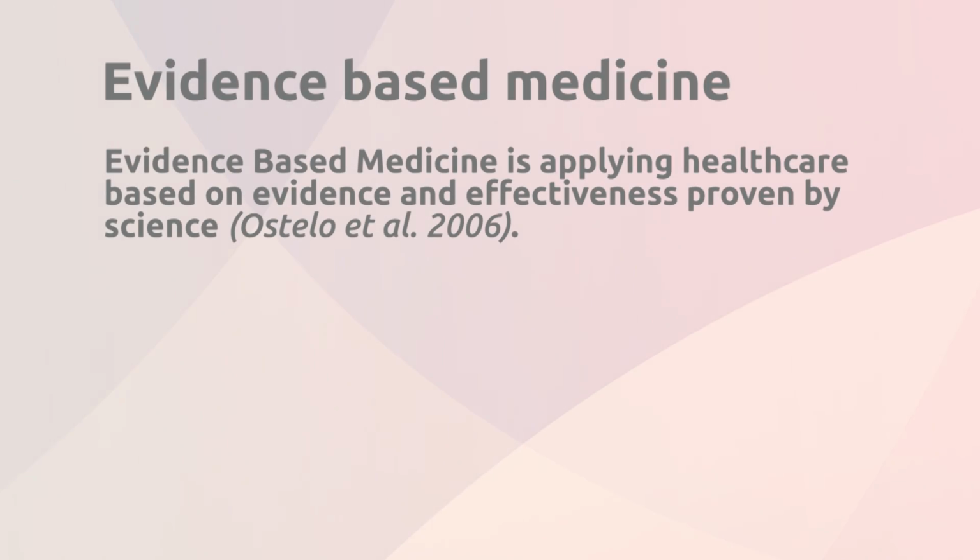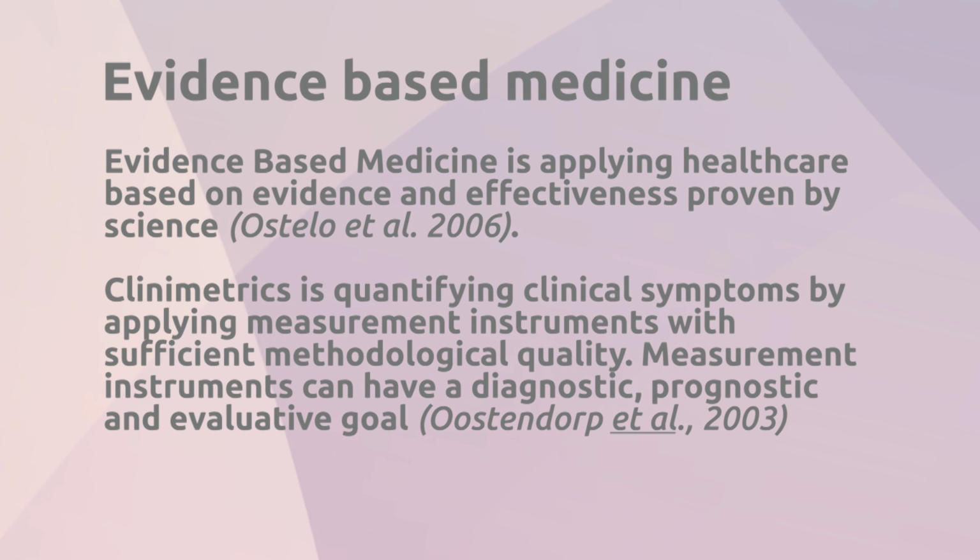Evidence-based physiotherapy requires studying the latest evidence and literature, integrating this evidence in practice, having a self-critical view, and applying clinimetrics. Clinimetrics is the term to indicate a domain concerned with indexes, rating and scales, and other expressions that are used to describe or measure clinical symptoms and physical signs. Measuring clinical symptoms can be done with several instruments, like, for example, questionnaires, using a goniometer, but also measuring on a structure level with musculoskeletal ultrasound.